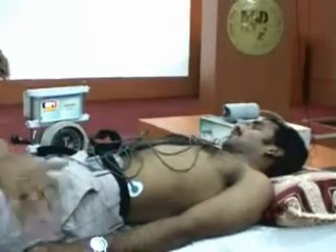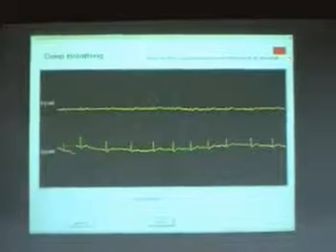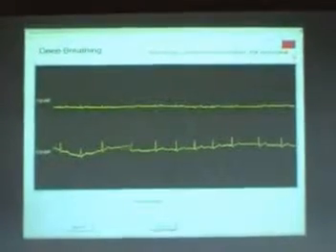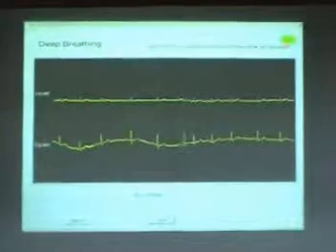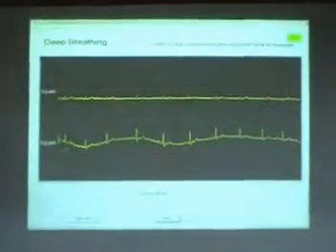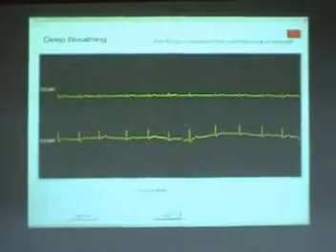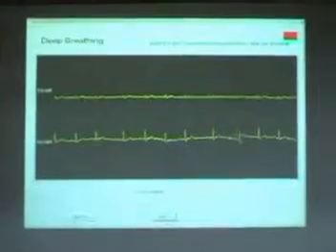Be relaxed. Now the red light is on. Now the patient will take in a deep breath and hold it. Now the green light is on. Now the patient will leave his breath. And this shows the variation for deep breathing. This is repeated 4 to 5 times.